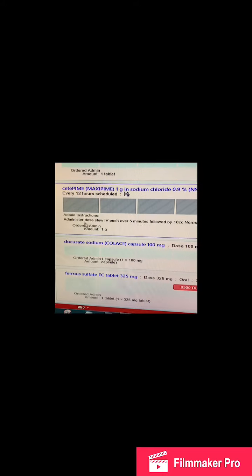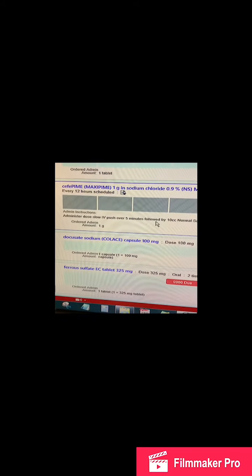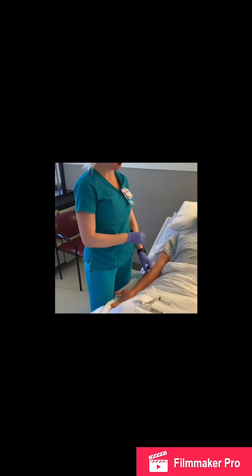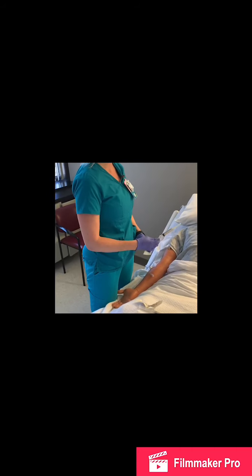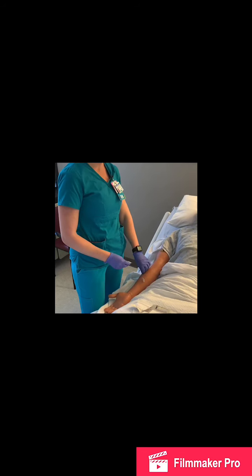So I'm then going to come over and double check my administration instructions. So here it tells me to administer it slow IV push over 5 minutes, followed by a 10 cc normal saline flush. All right, so now I'm going to just let Mr. Bob know. Mr. Bob, I'm going to be giving your antibiotics right now. I'm just going to inject them into your IV line right here.